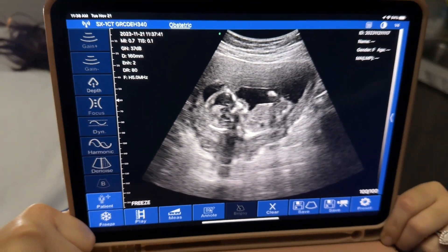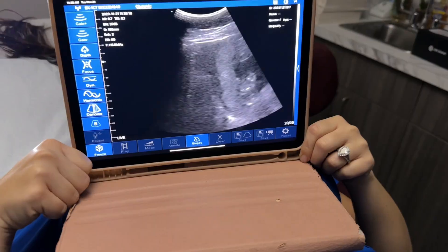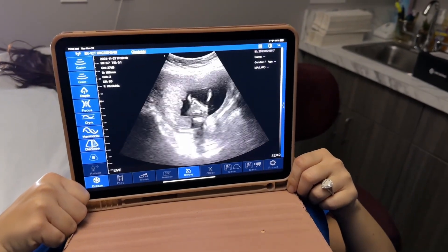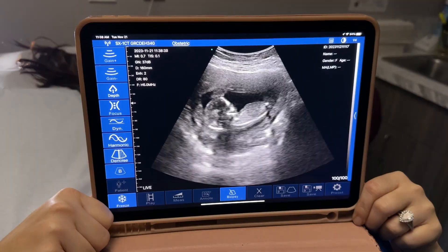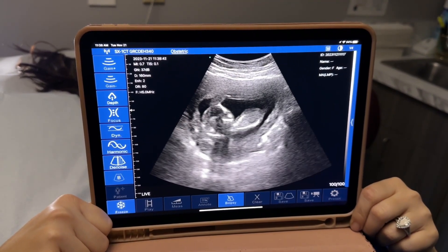This is a picture I just got and I'm gonna unfreeze and we're gonna go live again. So cute. Obsessed!